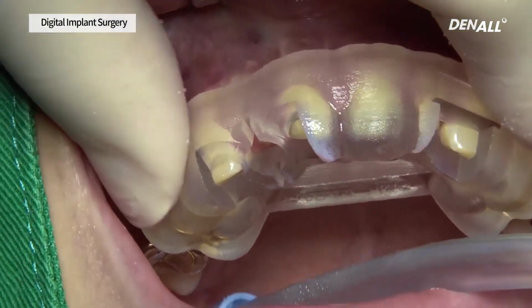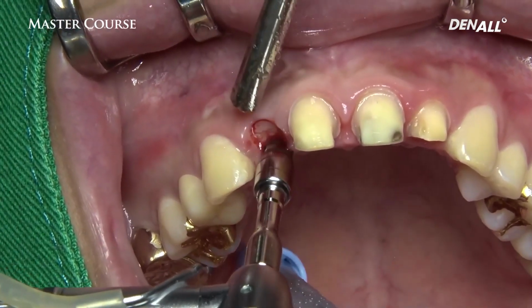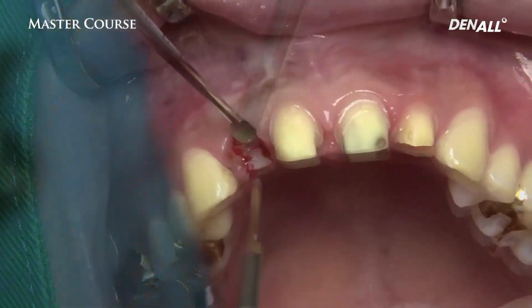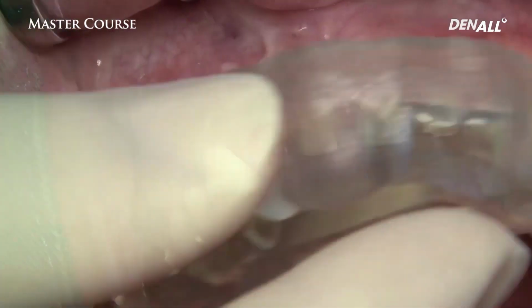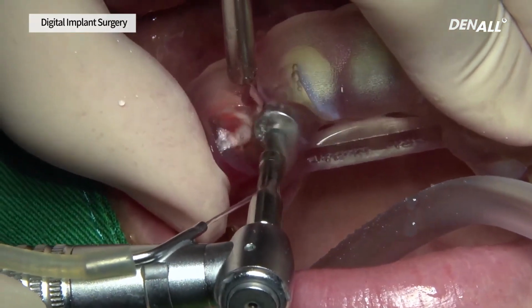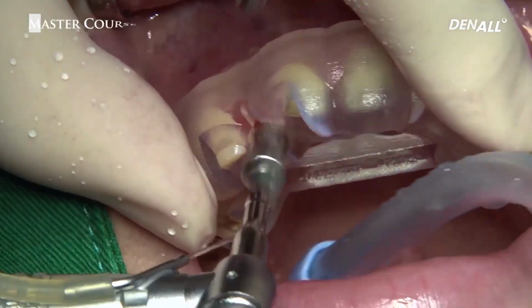Appropriate flap design, socket preservation, and the socket sealing technique are used to preserve critical aesthetic anatomical structures. So flapless surgery is planned for placing the implants. By doing flapless surgery, we can position the implants as planned, and for that, the best solution would be One Guide surgery. A tissue punch is used to remove the top tissue. After mounting the Osstem One Guide template, sequential drilling is performed.